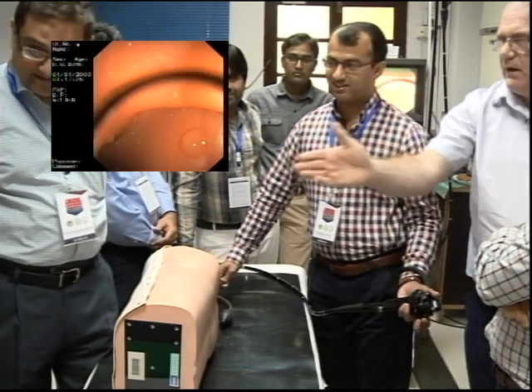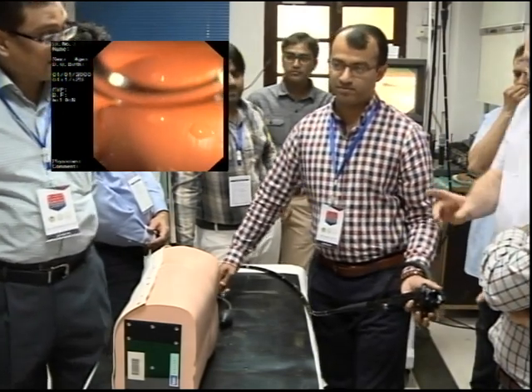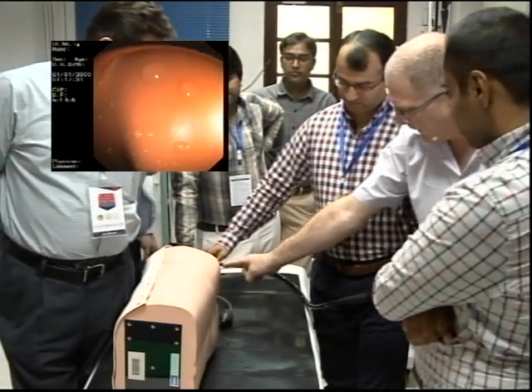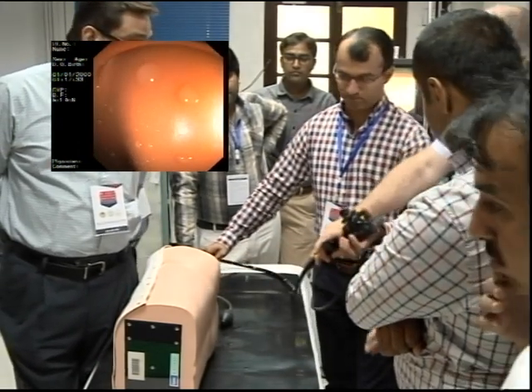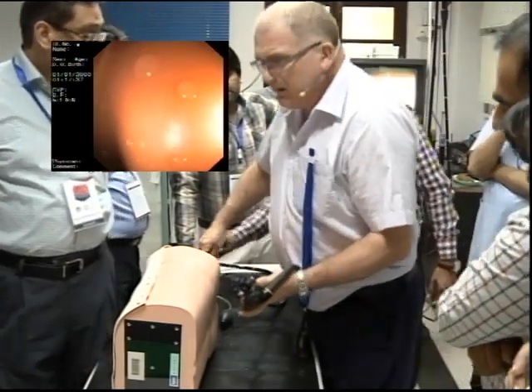There's the lumen running in front of you. Just slow down. Stop blowing, because blowing increases what you're doing. Look at how you've got the scope here. So let me just show you — just stand right here. You stand there. Right there.